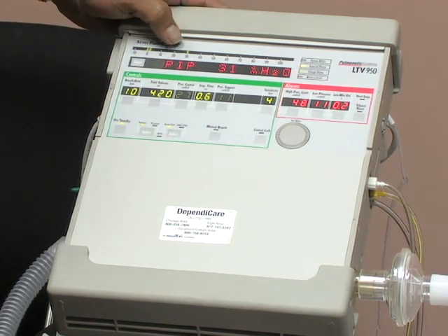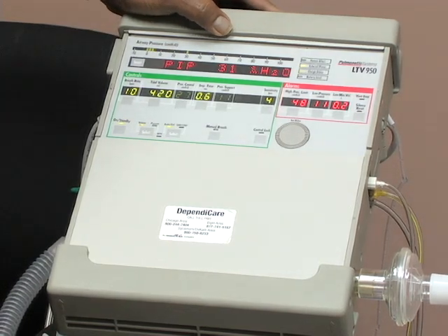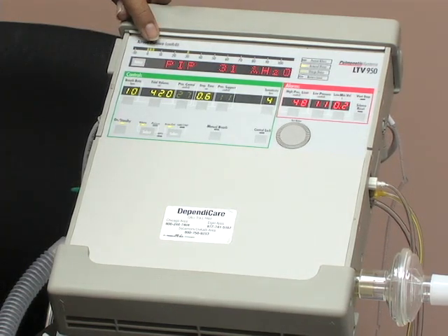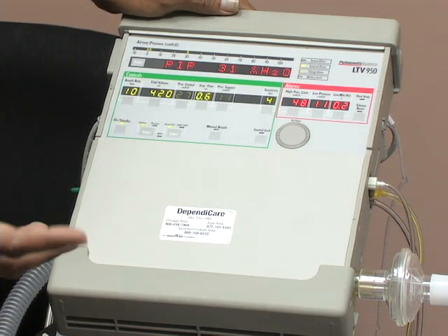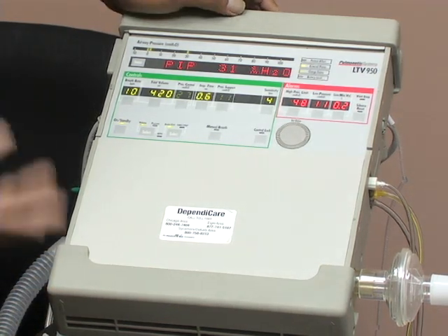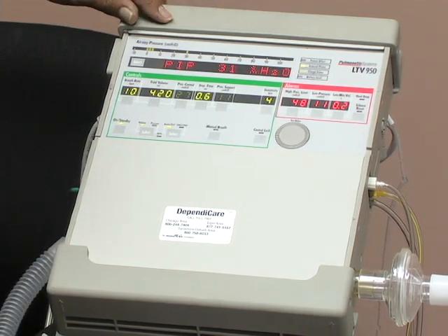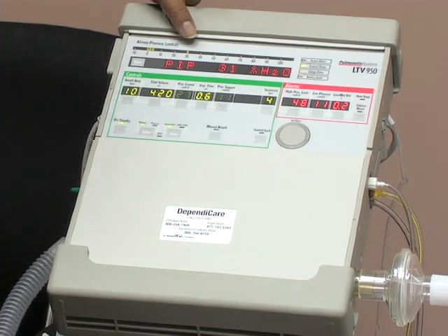PIP, peak inspiratory pressure, another extremely useful reading for our nurses. As you can see, the PIP reading is 31. This is the maximum amount of pressure that is infused or is inhaled by your client on each breath. If it is scrolling and you want to see your PIP, it's also shown on your graph here.